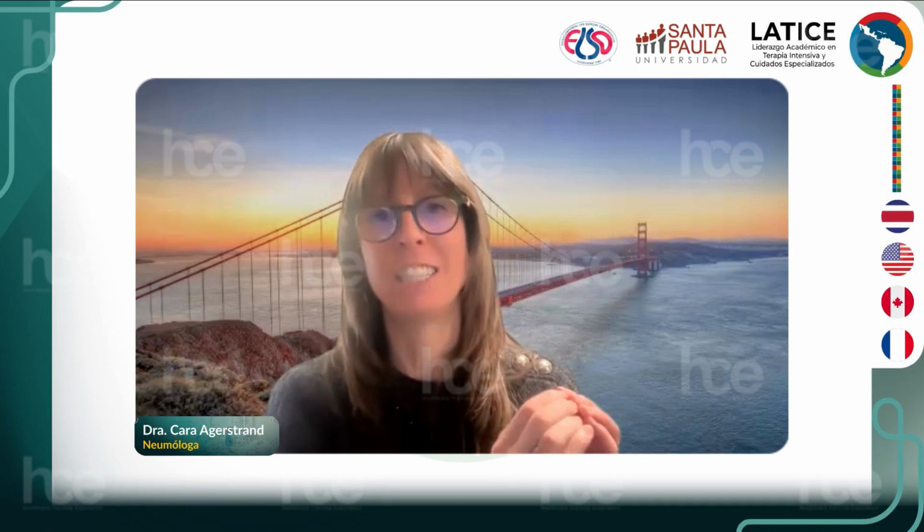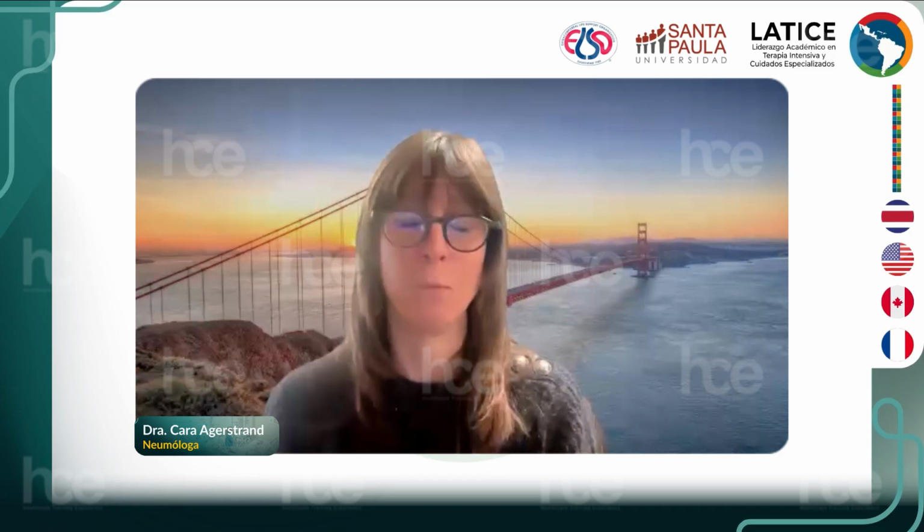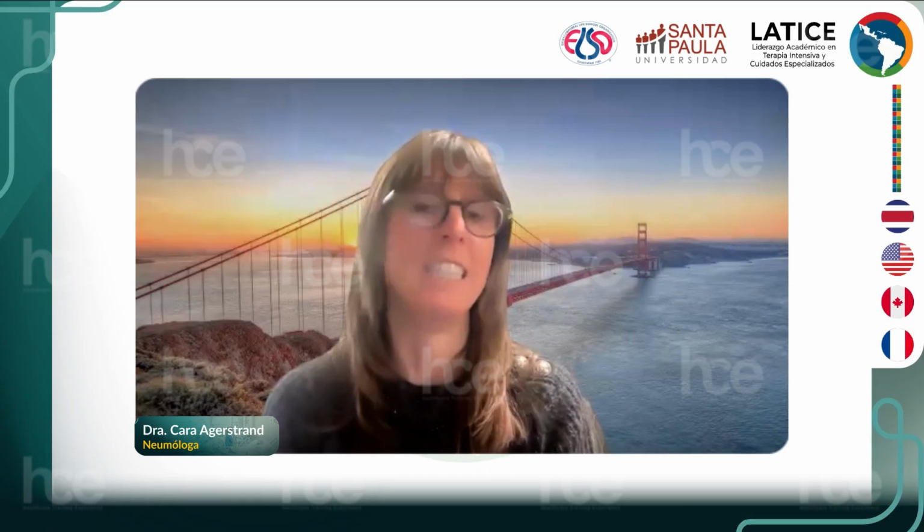I totally agree with both Eddy and Mathieu. And I think that our goal in ECMO is not physiologic perfection, it's physiologic adequacy. We want to support them in an adequate way to allow us to minimize these other harms, complications that naturally come with critical illness and ICU care, and even in non-ECMO patients, like sedation, et cetera.